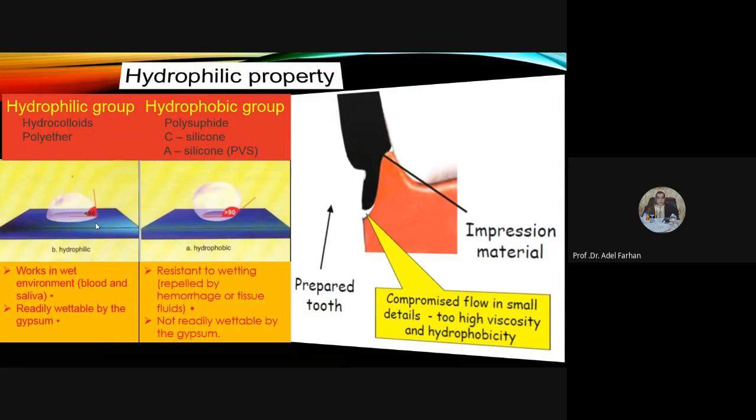Okay. وإضافة لذلك، الهيدروفوبيك ماتيريال cannot tolerate water. معناها شنو؟ يعني عندنا أي saliva بالarea of the preparation of dental arch during impression you have to have strict dryness to the area. أي moisture because the hydrophobic material cannot tolerate water ايش راح يصير بيها؟ سوينا fold and void تبين بالimpression especially بالاريا اللي نحتاجها مثلا finishing line او المارجن of the preparation. فلما يصير fold معناها it does not record for you the detail you need.